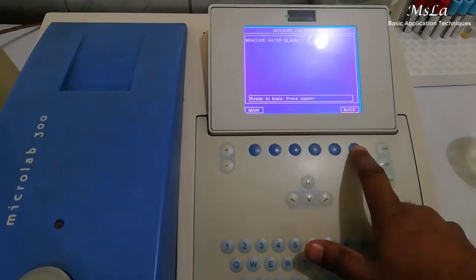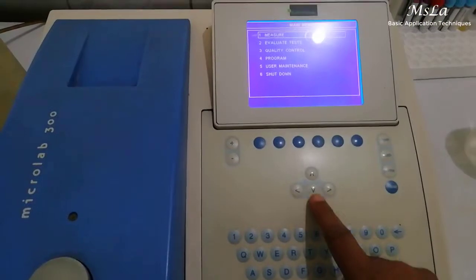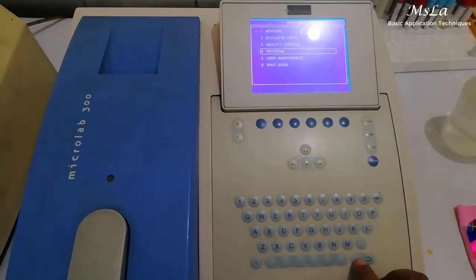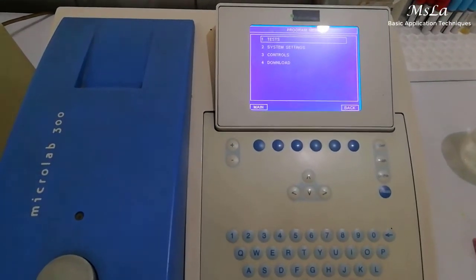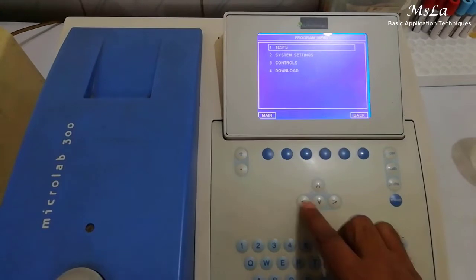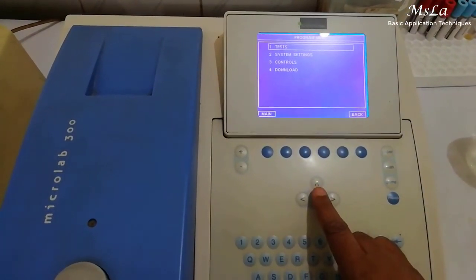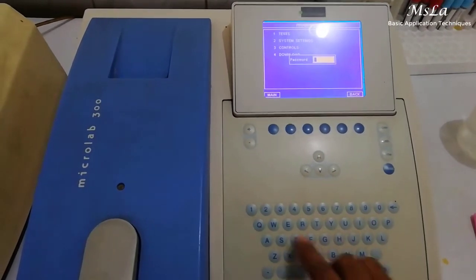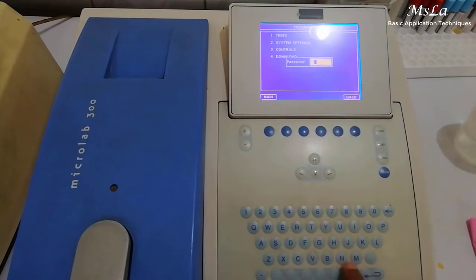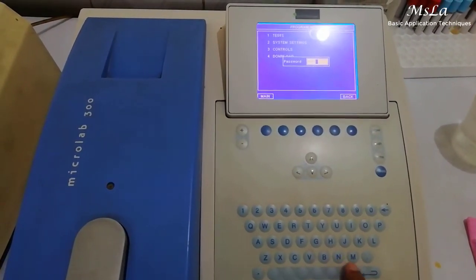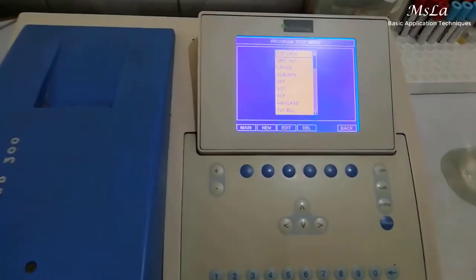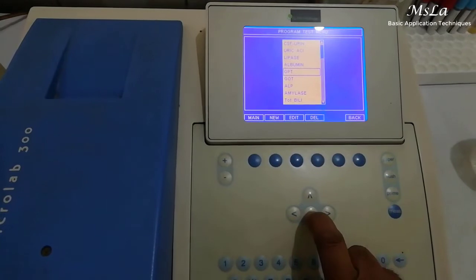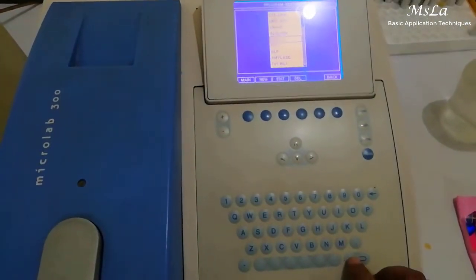Back to Main Menu. Selecting Program — Program. Enter. Number one test. Upper button. Enter password: admin. Enter. Main menu shows New, Edit, Delete Test. Program Edit. Enter GPT. Enter.